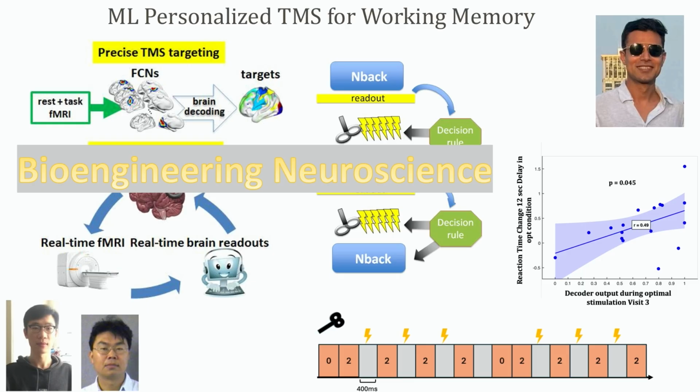Another thing we're playing around with is let's do something a little bit more sophisticated. Let's throw in some machine learning. Let's use some normative data. Let's combine it with the imaging data that we collect from the individual patients. Let's try it in something that we have seen traditionally in TMS studies. You might be able to affect with TMS even in an acute session, and say, let's combine those together.